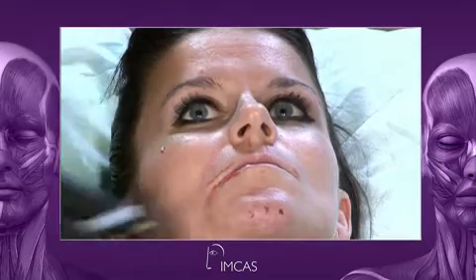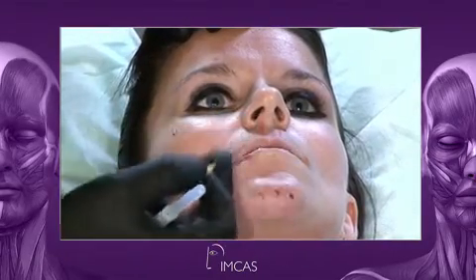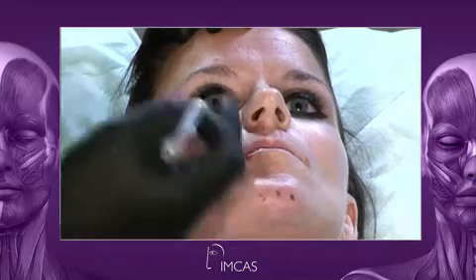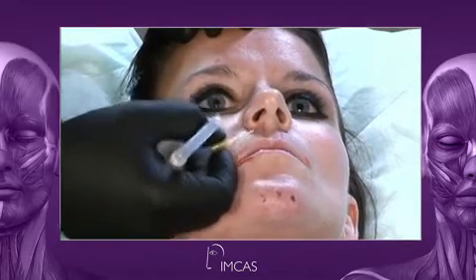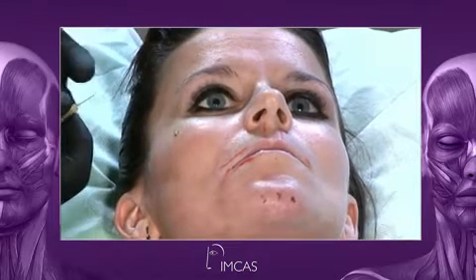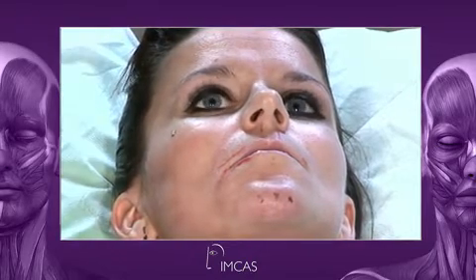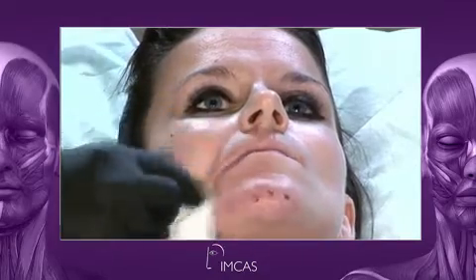Okay, so we're going to do this lateral from the columna filtrum with a microcannula. If I go for the filtrum or for the Cupid's bow, of course, I don't mess around with cannulas. We do this with a sharp needle, so we will do that as well.